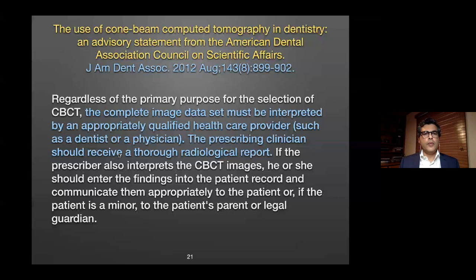So this is from the Journal of the American Dental Association in 2012. You can read this paper, the references are here. I'm just going to give you the very pertinent information. The complete image data set must be interpreted by an appropriately qualified healthcare provider. Now, as a dentist, you are qualified to prescribe and read a CBCT scan. The prescribing clinician should receive a thorough radiological report. If the prescriber also interprets the CBCT images, he or she should enter the findings into the patient record and communicate them appropriately to the patient.